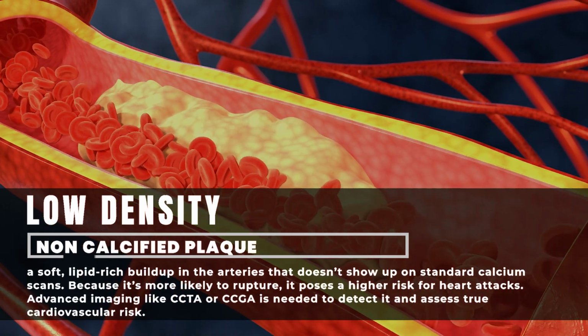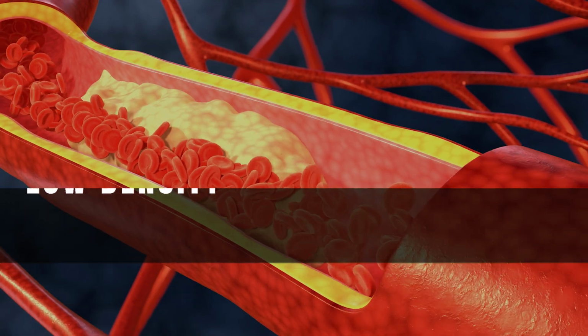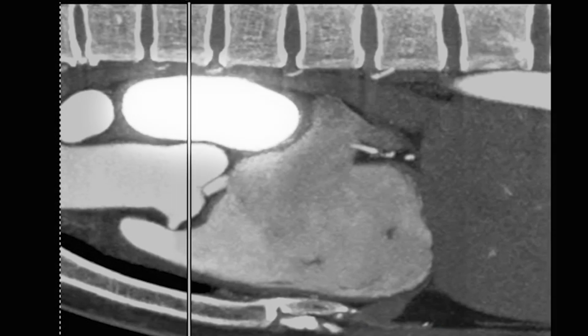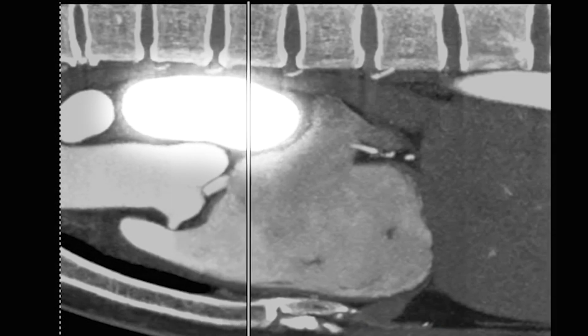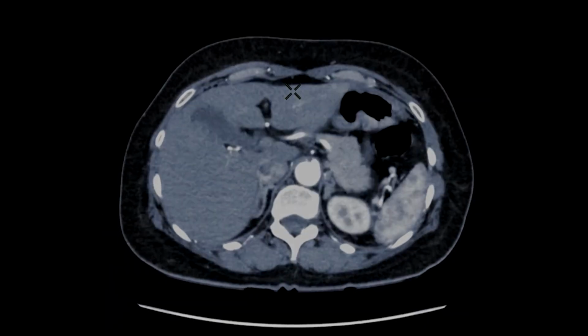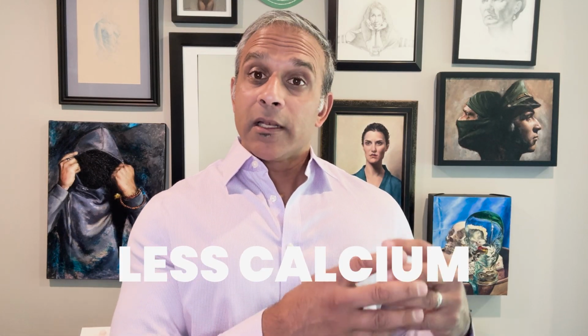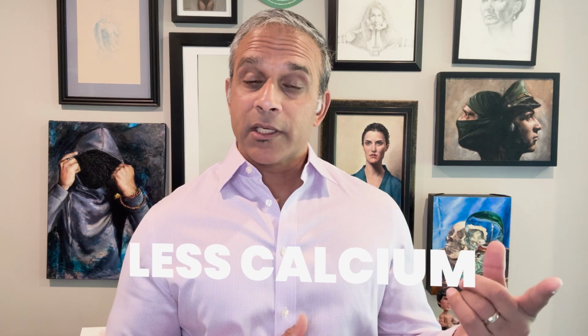When we look at a CAT scan, the things that light up really bright are the things that are really dense. That's like bone, and that's like calcium. So when we look at a plaque and we see something light up dense and we see calcium, it's easy to detect. A test like a CAC or a calcium score, that's what it's detecting. When we start looking more specifically, as the brightness goes down, the density decreases. And what that means is that we have less calcium and other types of tissue, namely cholesterol.